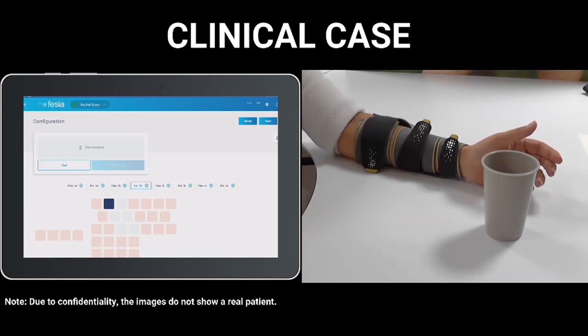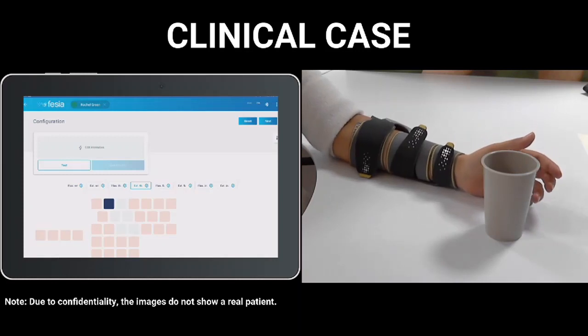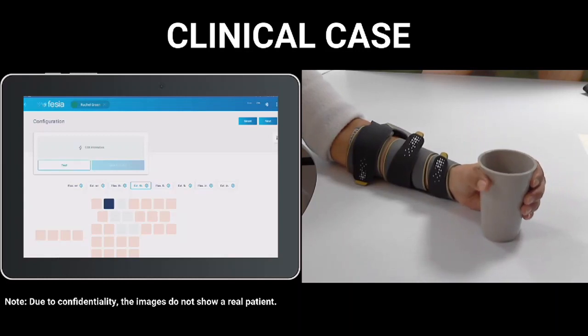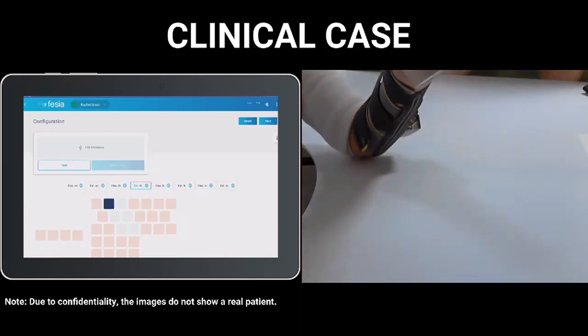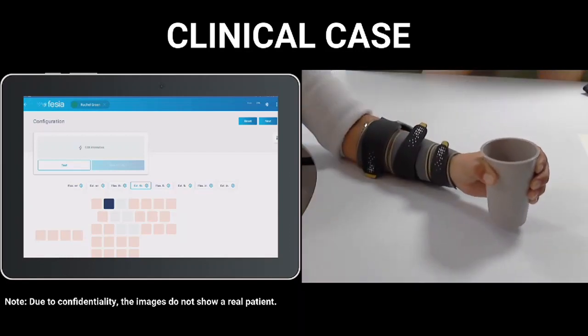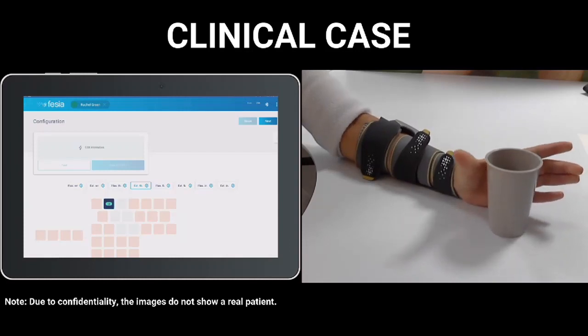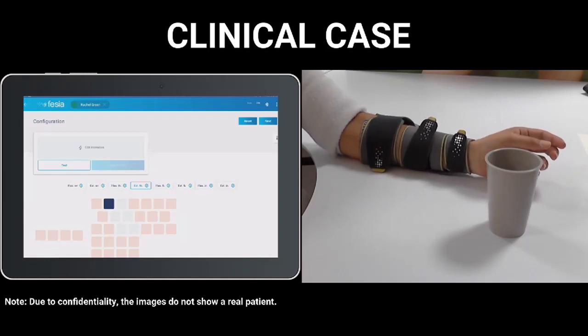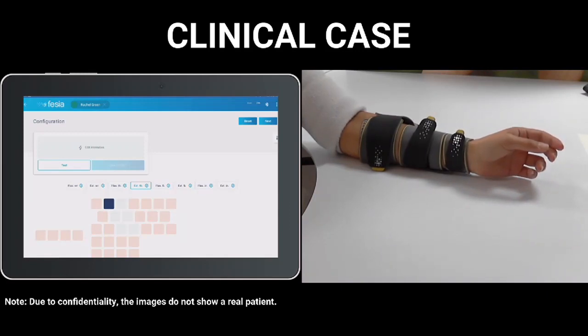We will do the same now, Rachel, but once you have grasped the glass, you are going to try to drink from it. Okay, let's try to grasp it. I press test to extend the thumb. Once it is grasped, try to drink. And now we release it. I press test. Perfect. And this is an easy way to use Fesia Grasp in a very functional way by only stimulating the desired movements.